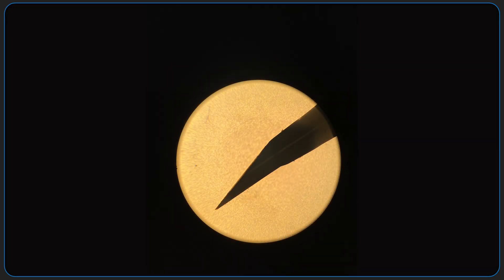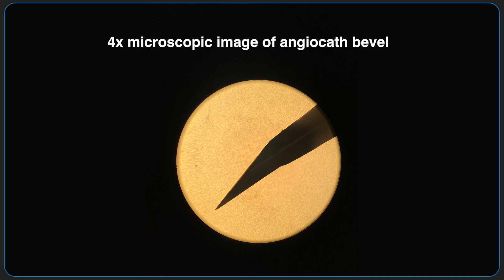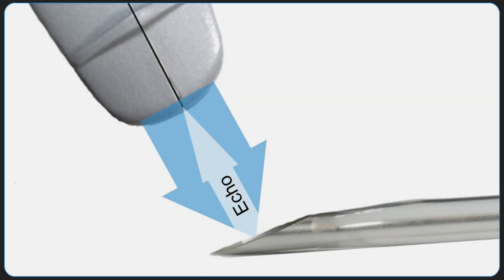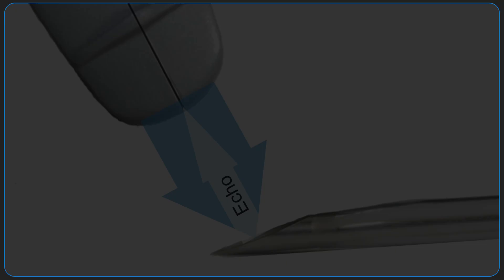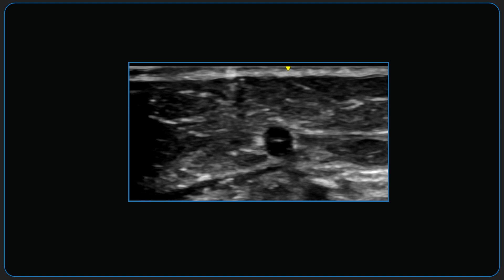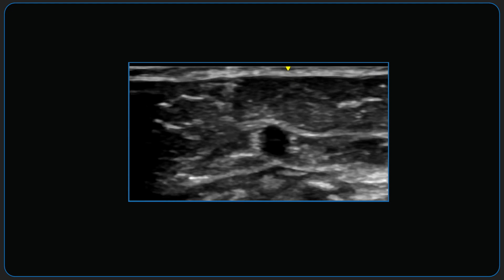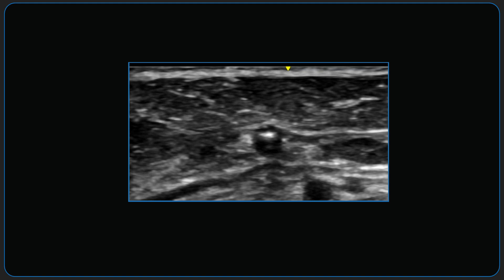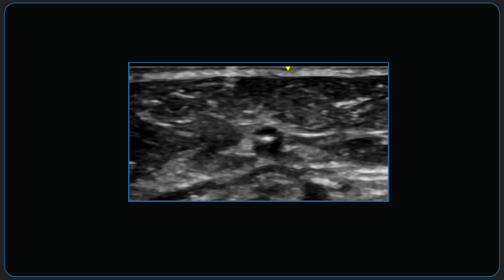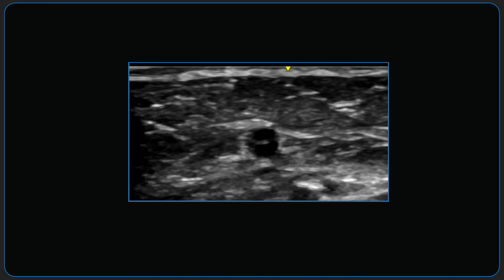We can exploit a key principle of ultrasound imaging to allow excellent visualization of the needle tip. The bevel of the needle, which is right next to the tip, acts like a specular reflector under certain conditions. A specular reflector is a smooth surface which, when aligned perpendicular to the direction of the incoming ultrasound beam, reflects it directly back at the ultrasound probe. This bounce-back ultrasound beam creates a bright or hyperechoic image of the bevel on the ultrasound screen, which is typically brighter than surrounding tissue structures, which usually create a more diffuse pattern of reflections.